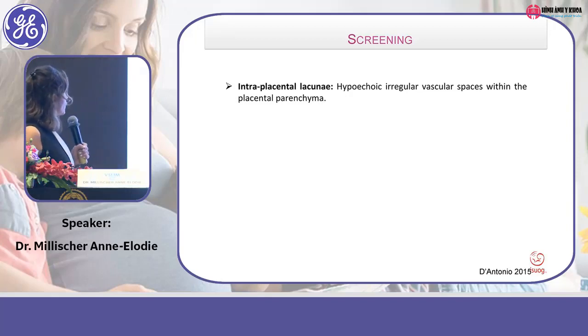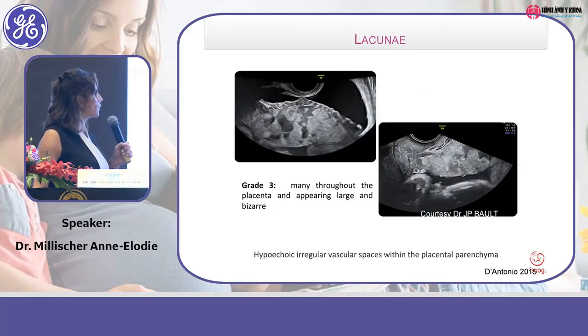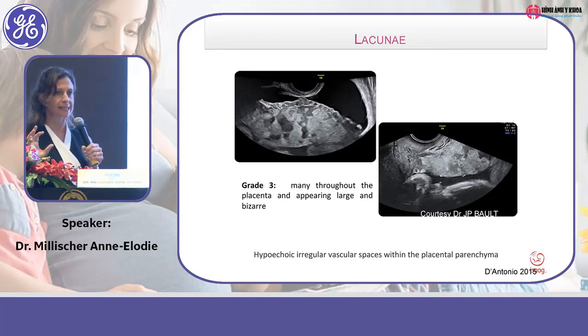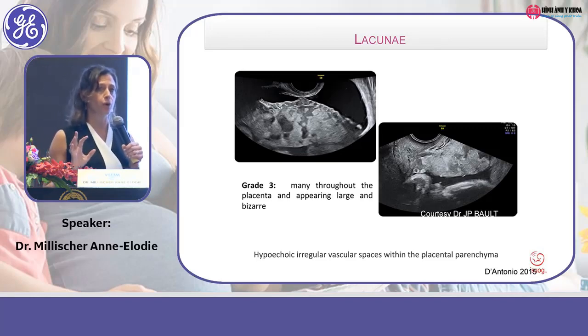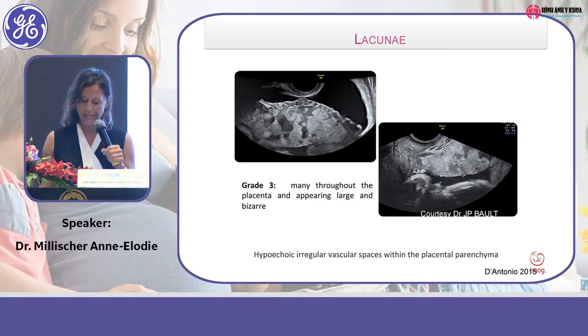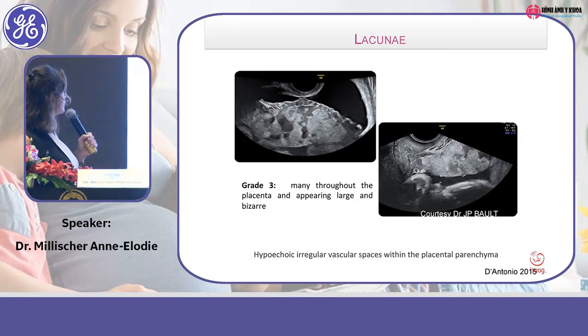Recently some FIGO consensus guidelines were published in order to correctly and systematically describe all the points to provide a precise diagnosis of placenta accreta. And you have the list here.